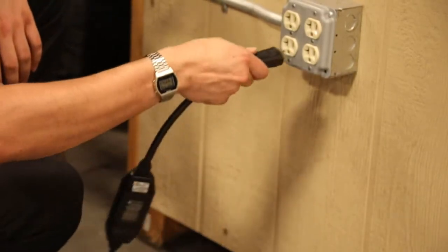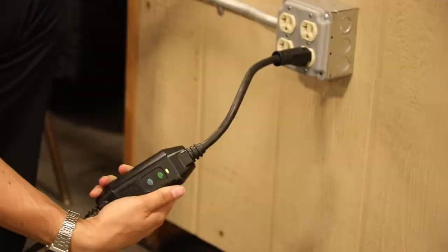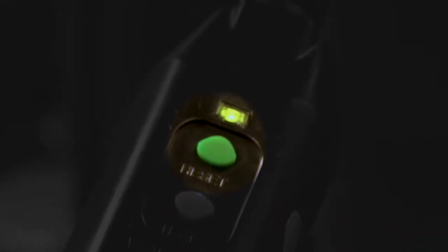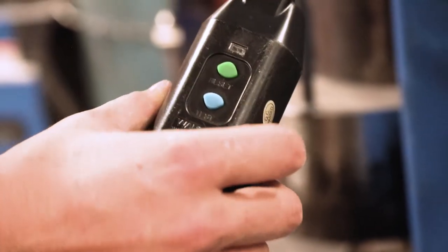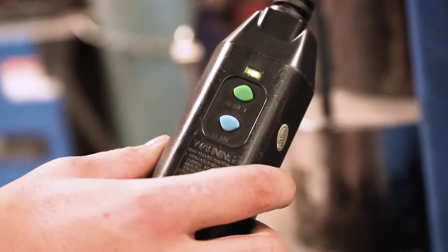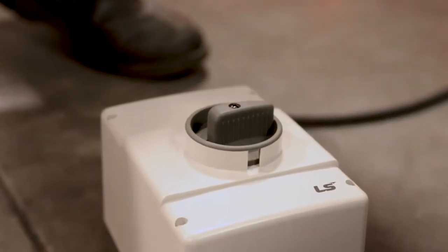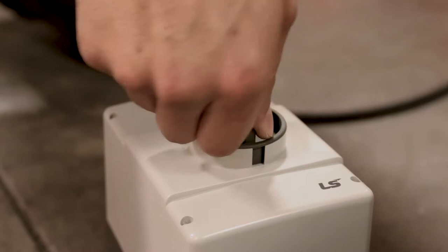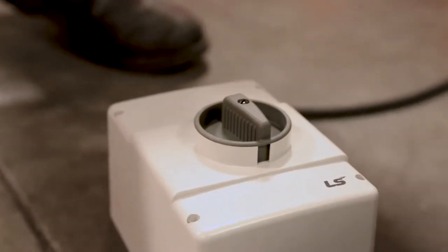If the lift is a portable model, ensure the lift is connected to power and that the inline GFCI has a green light on. This indicates that power is being supplied to the lift. If the light is not on, try pressing the reset button. If the lift is equipped with a manual disconnect, ensure that the disconnect is in the on position, allowing power to be supplied to the lift.